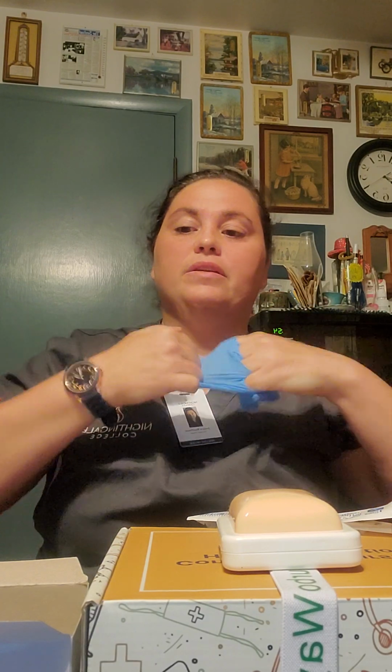I would dispose of these in the trash. I would perform hand hygiene. I would go out of my patient's room and shut my patient's door for privacy, and then I would document that I gave them the 1 ml injection of heparin. That's the end.